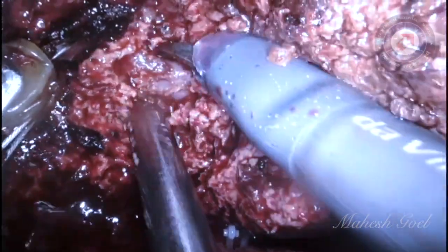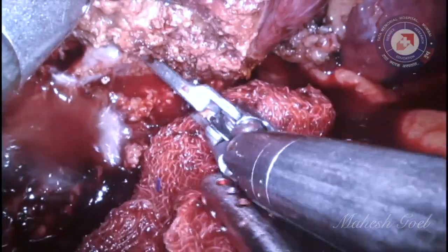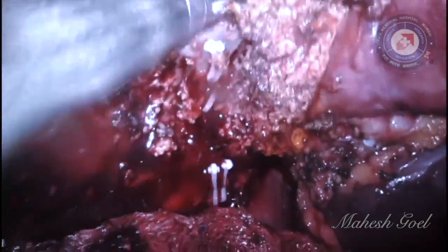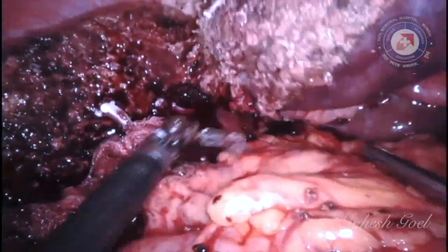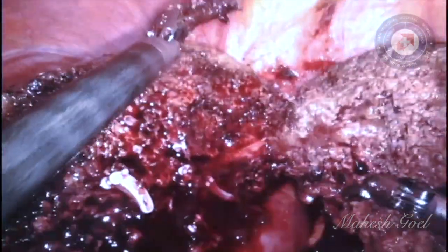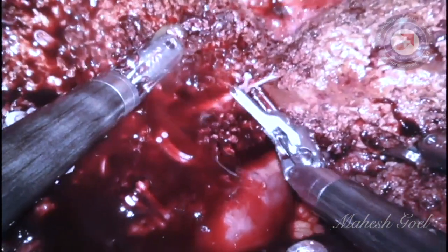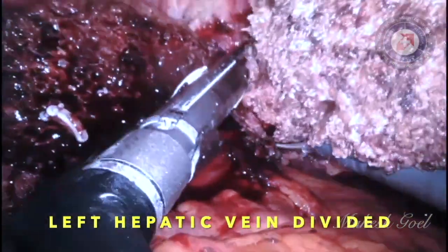As we proceed with the transection, the surface of the middle hepatic vein is seen, with a tributary from segment 4 going to the MHV, which is ligated and divided. Transection continues with division of any vessels encountered. The left hepatic vein is then divided using an Echelon 60 stapler.